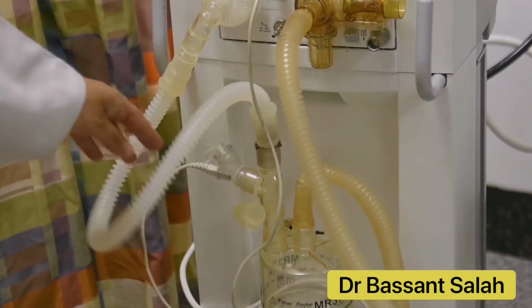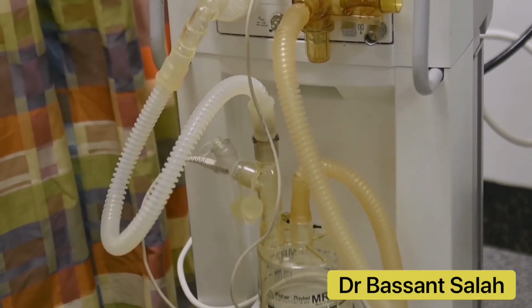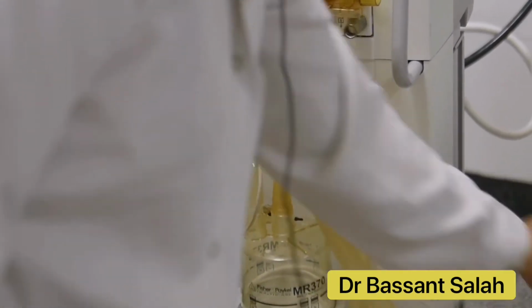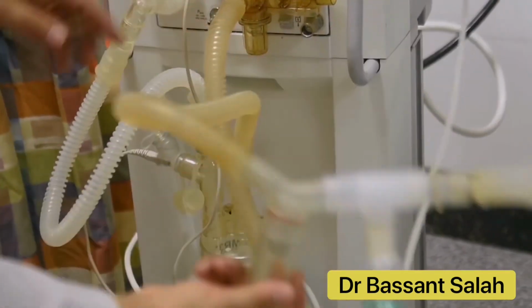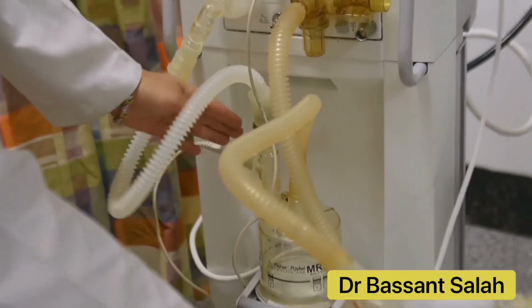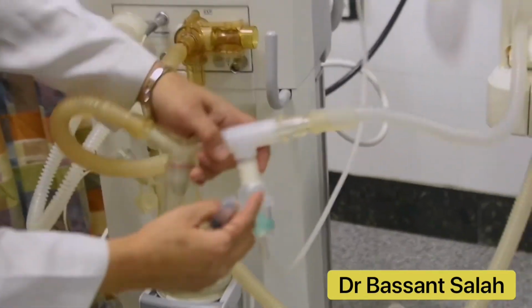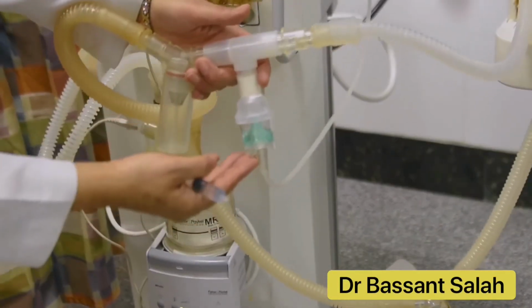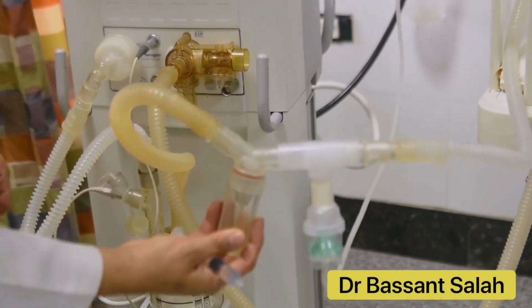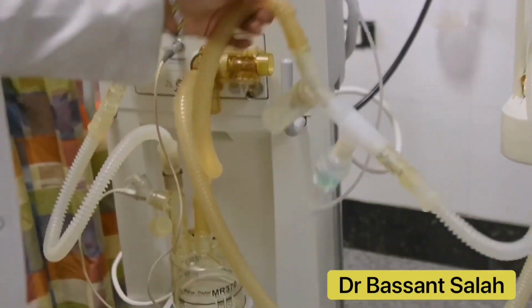And we continue until the medication is over. And we have a value here. The value here is that if we add the medication, it is above the ventilator circuit. But if we add the medication here, it is below the patient circuit. So it is liable to contamination from the patient secretion more than the vibrating mesh nebulizer.